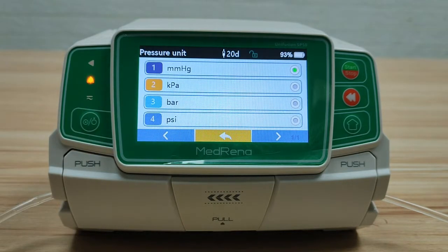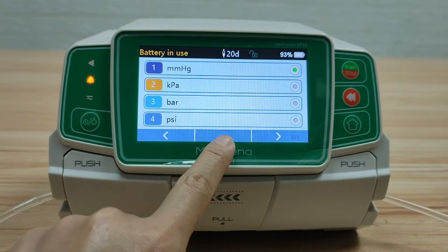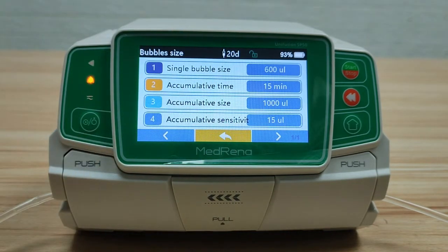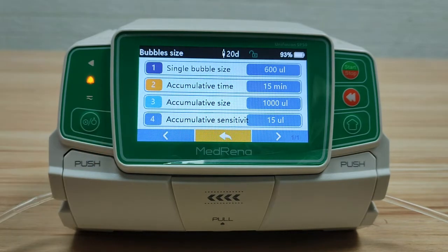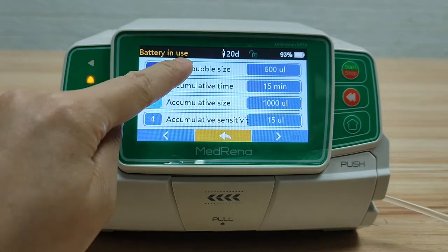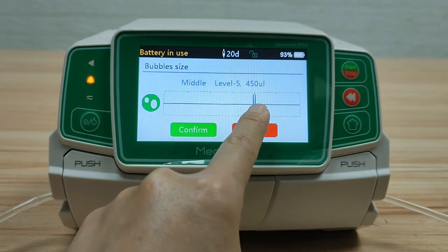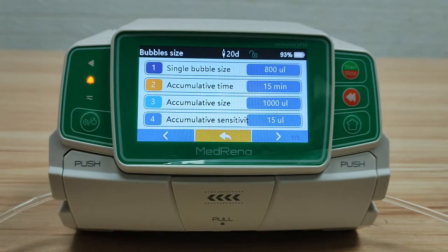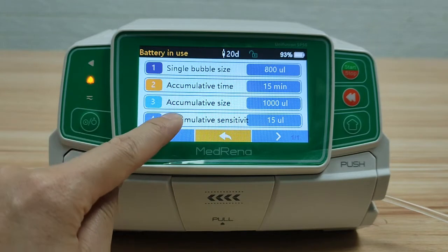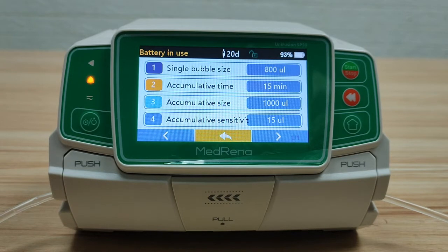Pressure units: there are four different pressure units available for choosing. Bubble size: in this setting we can select the single bubble size or accumulative size that will trigger the alarm. For single bubble size there are seven different levels for choosing. We can also select accumulative time or accumulative sensitivity that will trigger the alarm.